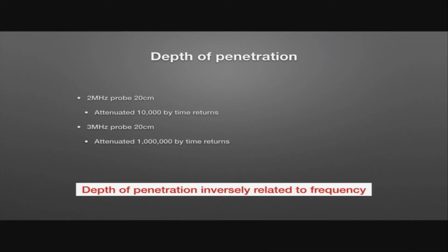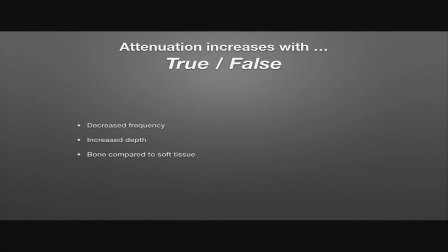So it's important to remember that the depth of penetration is inversely related to frequency. So let's ask one of the final questions. Attenuation increases with decreased frequency, increased depth, or bone compared to soft tissue. True or false?